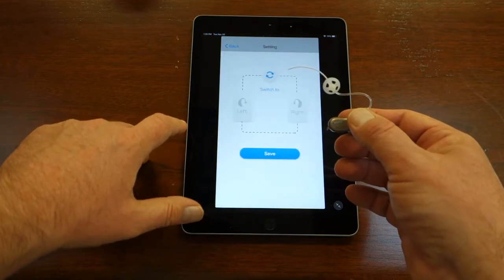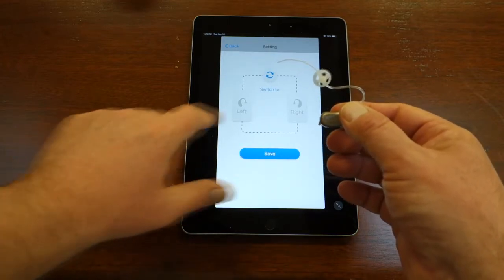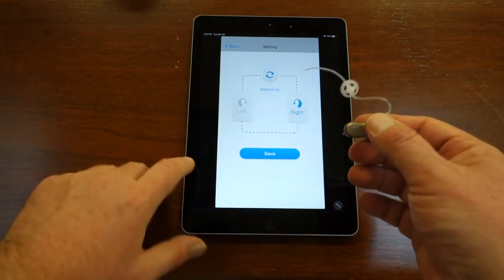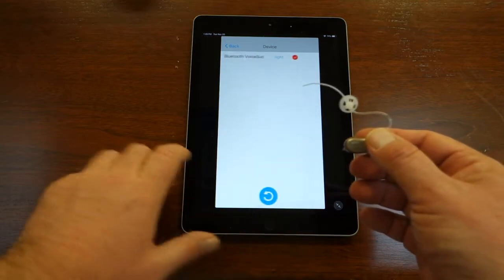Touch the words Bluetooth VoiceBud for the Settings screen. If the VoiceBud you turned on is for the right ear, select Right. If it's for the left ear, select Left. When the Save button lights up, push that to save the setting.